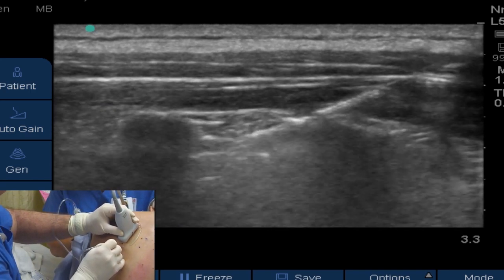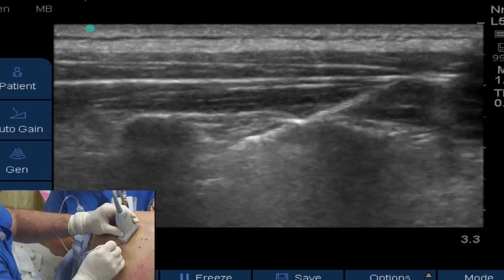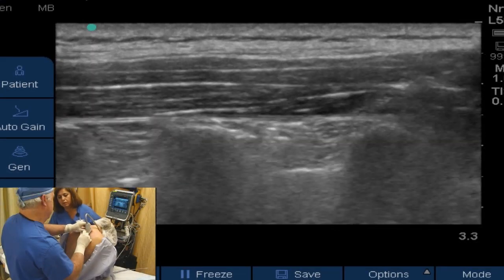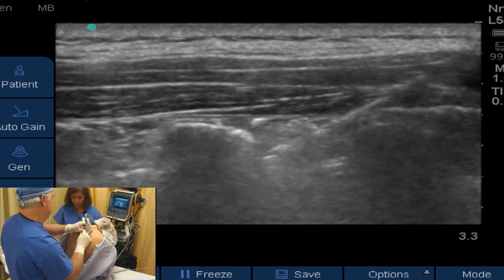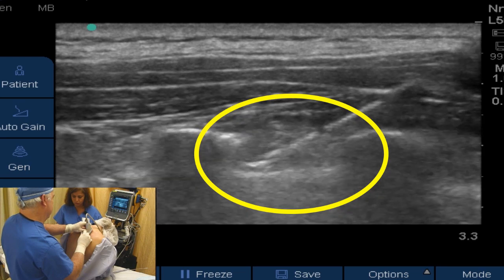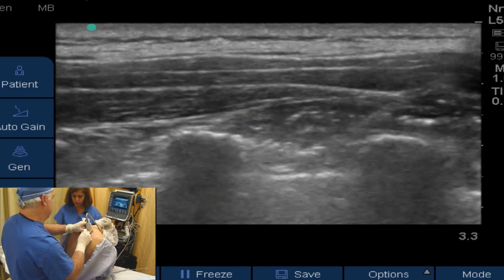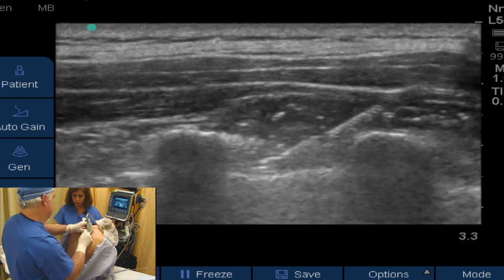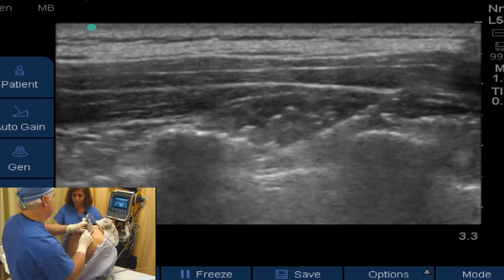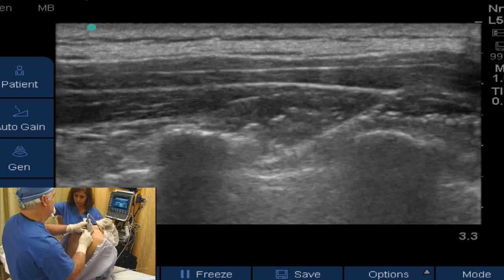It's very, very critical in this block that you know where the tip of that needle is and you don't puncture the pleura and get into the lung. You can see our Sonotui advancing between the vertebrae and you can see the last two centimeters — the echogenicity of this needle really shines up well and it's extremely helpful when you're using this steep angle to be able to see it as you're approaching the pleura.